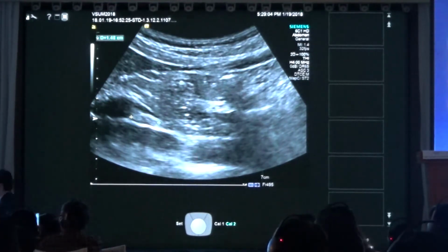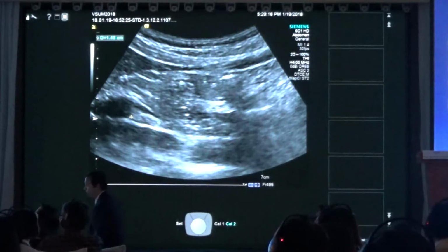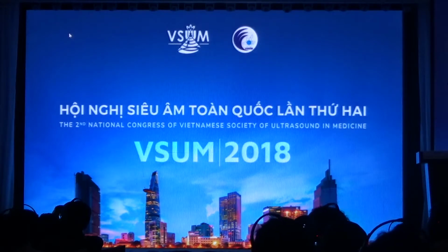However, our sonographers always come and say, oh, the patient ate, so I'm not going to do them. You can do the patient, and as long as they're normal, they're normal. If they eat, it will only raise the value. So what we usually do is we will try to do the patient, but if the values are high, then we let the referring doctor know that it may be artificially elevated and that they may want to send the patient back if they need to for clinical reasons to get a better value.